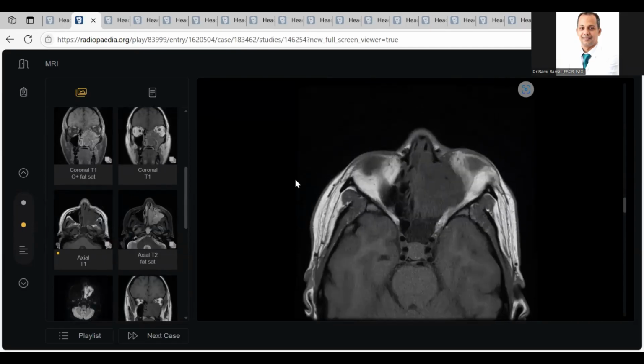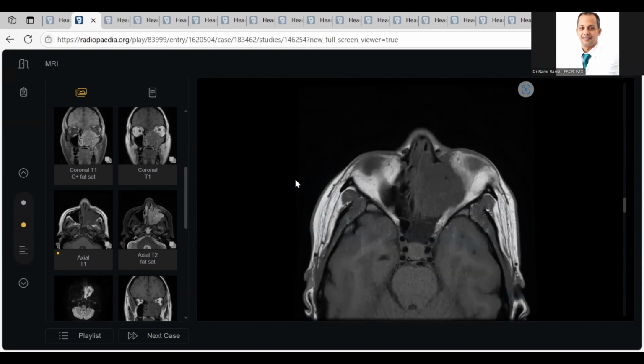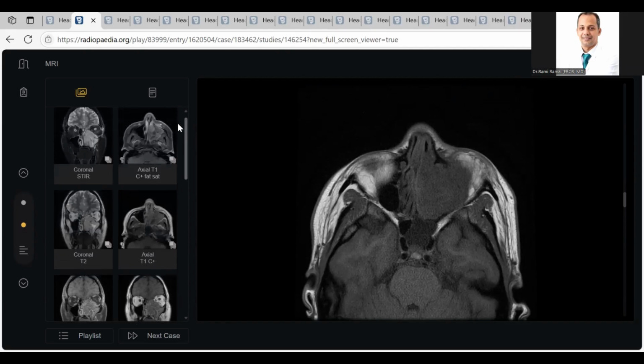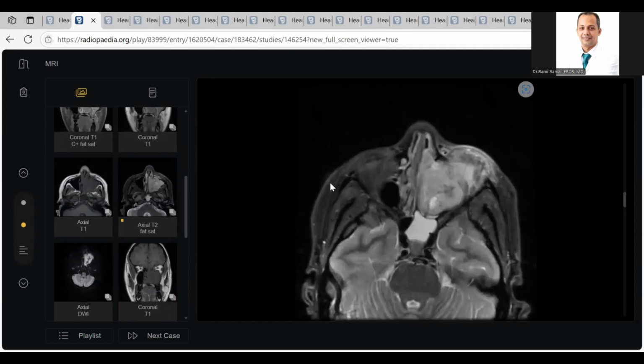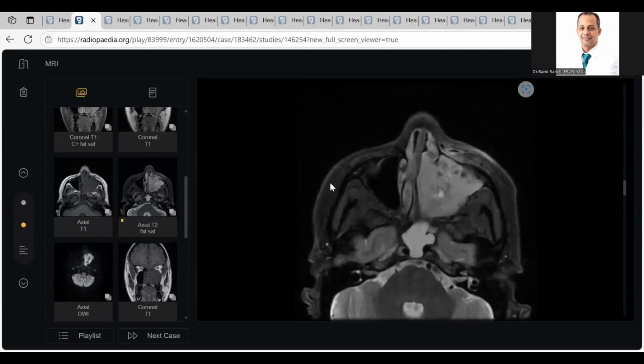By conventional imaging, we can lose the case in the exam if we don't know our basics. Fungal sinusitis should have some sort of high T1 signal and some sort of low T2. Very critical. I know that most of you know this criteria, but I wanted to reassure you, because in the stress of the exam situation, most of us forget many basics.